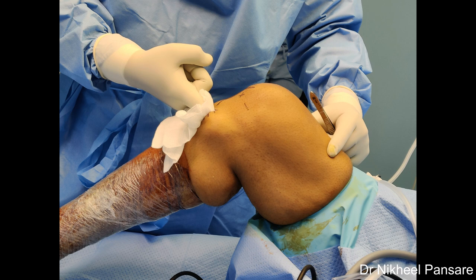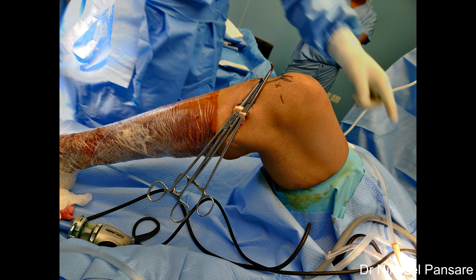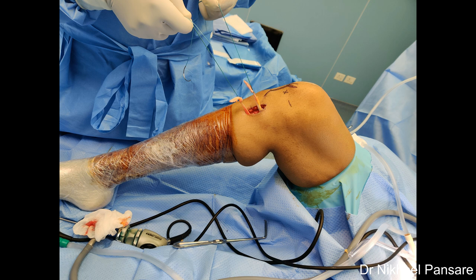Cut open the fascia along the superior margin of the semitendinosus tendon, taking care not to injure the tendon. Lift the fascia with tooth forcep and extend the opening using dissecting scissors. Take out tendons using mosquito forceps. Separate semitendinosus and gracilis tendons. If the patient's height is good, generally semitendinosus tendon is enough. Here in this case we took out both semitendinosus and gracilis tendons in order to get good graft thickness as the patient is a professional athlete. We prefer a closed stripper to harvest the graft, so the tendon attachments are stripped off the bone with some amount of periosteal sleeve to achieve better length.